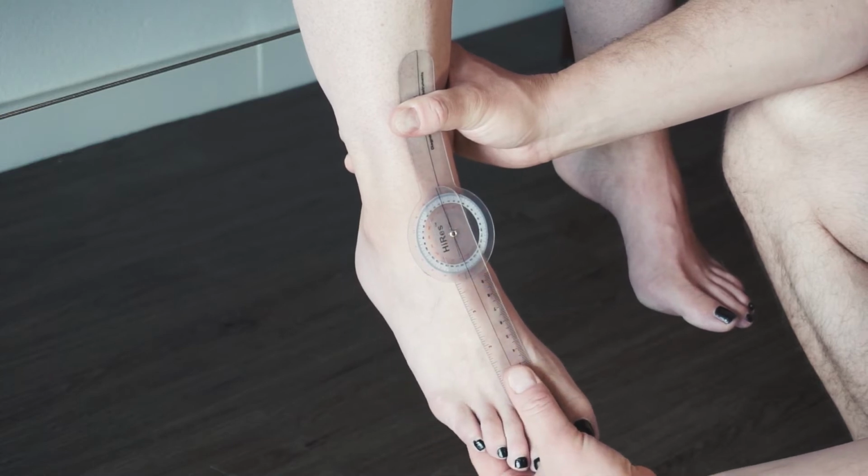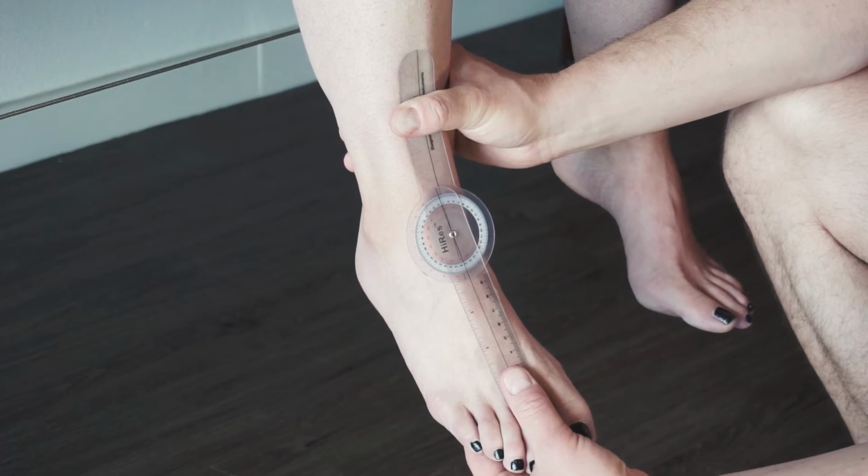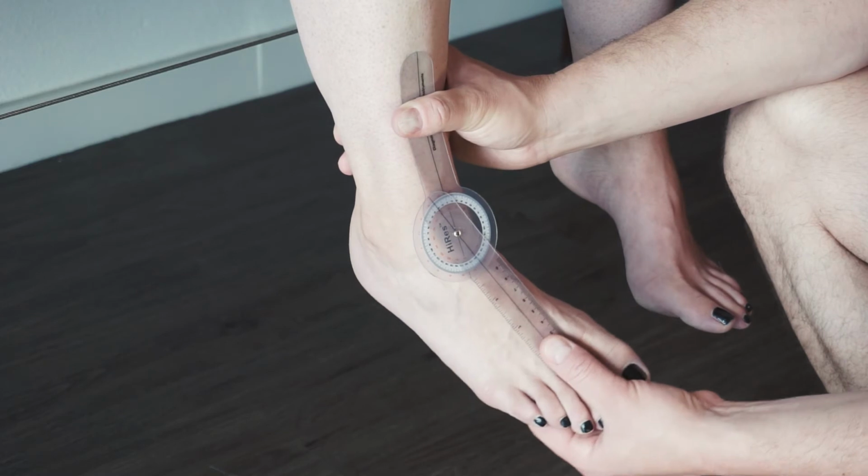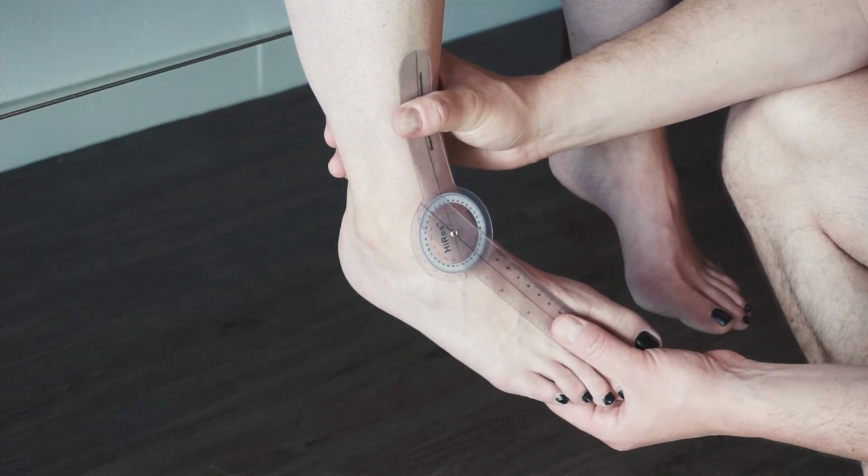She's already slightly inverted, about 5 degrees. Doesn't matter, she has 5 degrees of inversion already, but that's not a measurement we're going to write down at all. Remember from the Goni video, first thing that's going to happen is the patient's going to actively move into inversion. So luckily my patient actually knows what that is, so I don't need to demonstrate it.